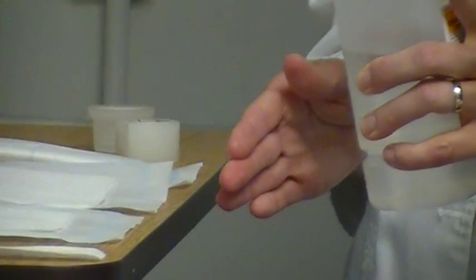Now, the amount of solution that you are going to pour into your 4x4 really depends on how wet you need that to be. If you have a wound that drains a lot, you probably don't need a lot of normal saline on your dressing. If you have one that's not draining very much, then you would need to put more saline. Just remember what your goal is. Your goal is to have a dry dressing on there at the time of removal in order to debride the wound.